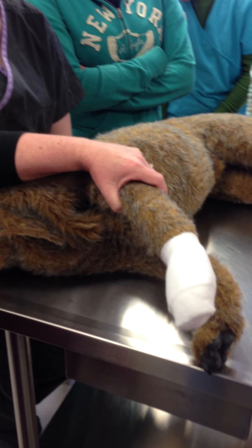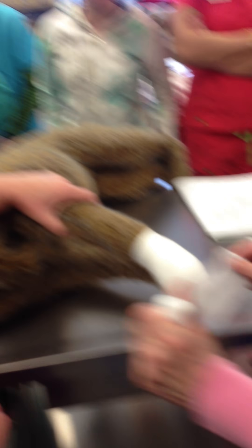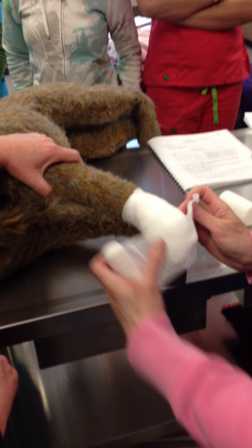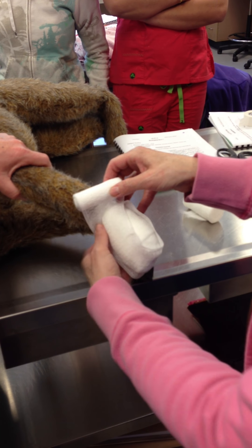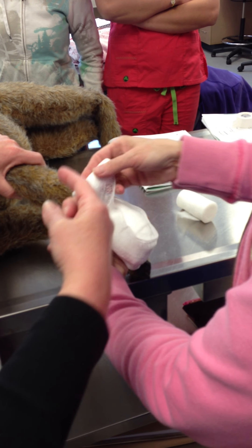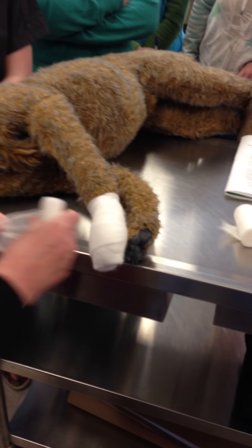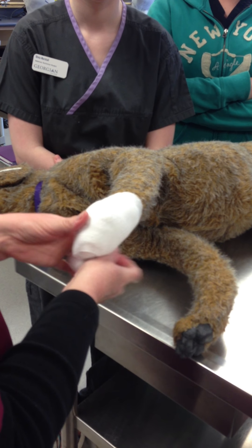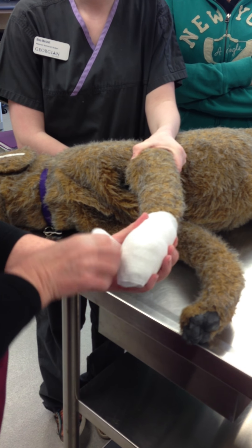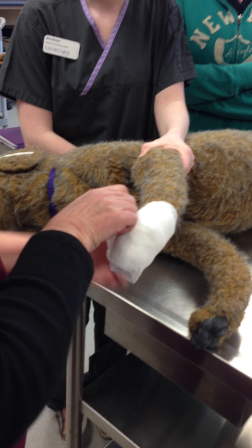And with the conforming gauze — would you start like that now? You can do that, or you can just start wrapping up the toes. Now I want to see you do it. This is the way that I do it. So because it's conforming gauze, it conforms really nicely if I don't drop it. I start at the toe and then roll my way up.